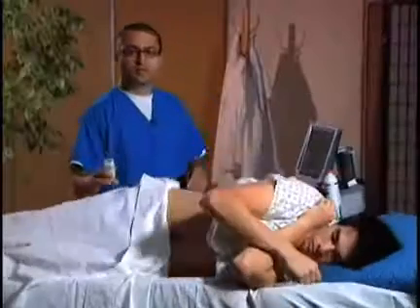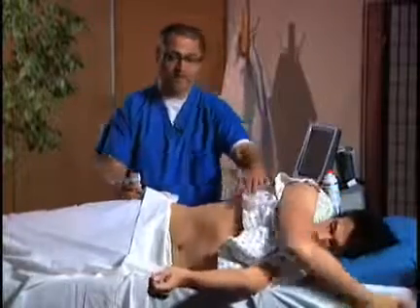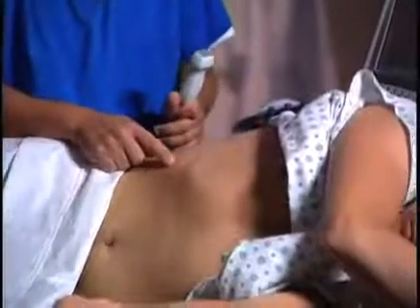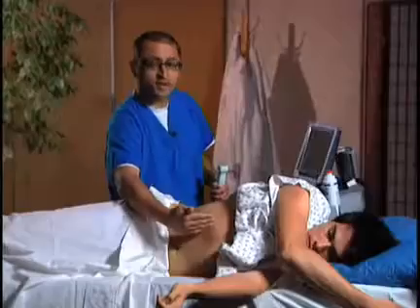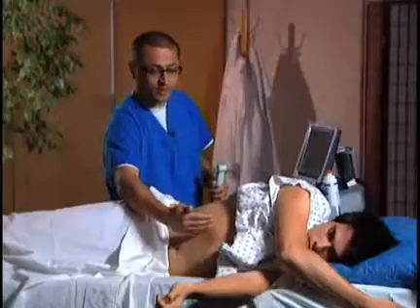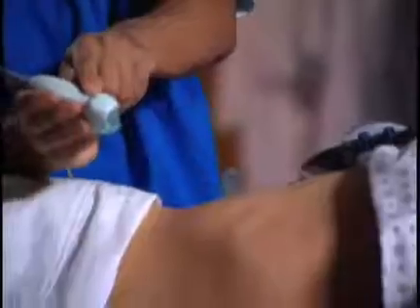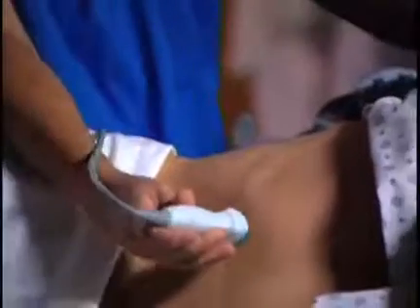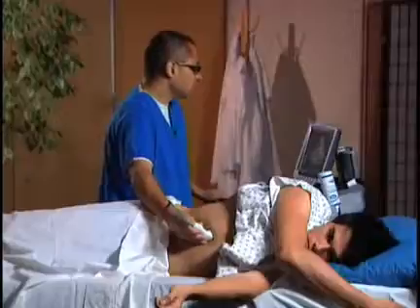So I have the patient turn to the left lateral decubitus position, and I'd like to have their elbow up as well. The next thing I do is I draw an imaginary line along the costal margin, and we have an imaginary perpendicular line along the line of the shoulder. So then I'm going to put my transducer right about in this area, and I should have a very nice long axis of the gallbladder. So here's our transducer marker right here. Again, I'm at the costal margin pointing toward the shoulder, and I'll try to find the gallbladder.